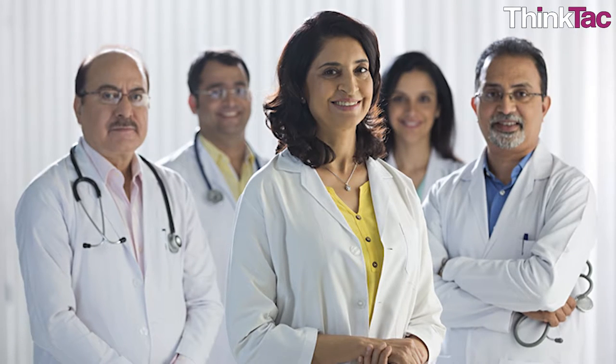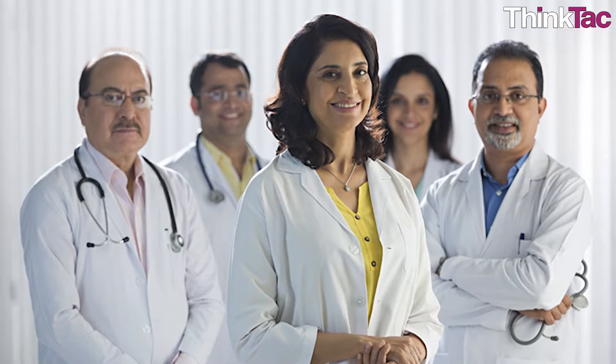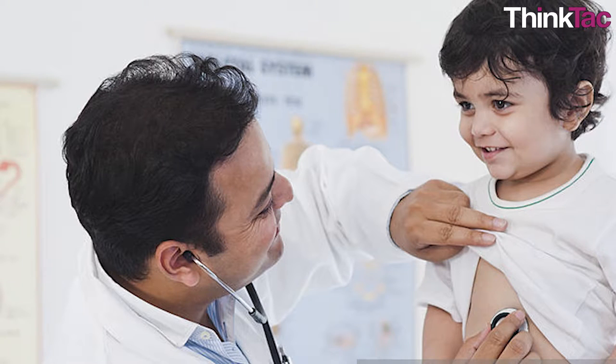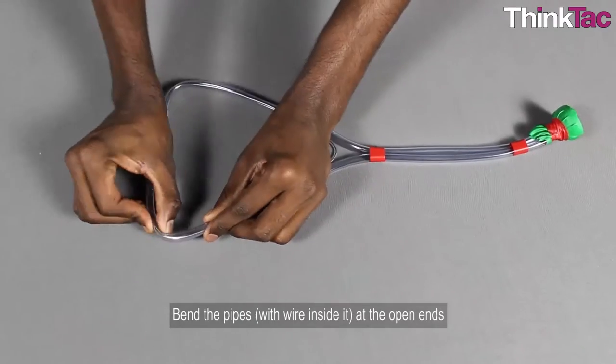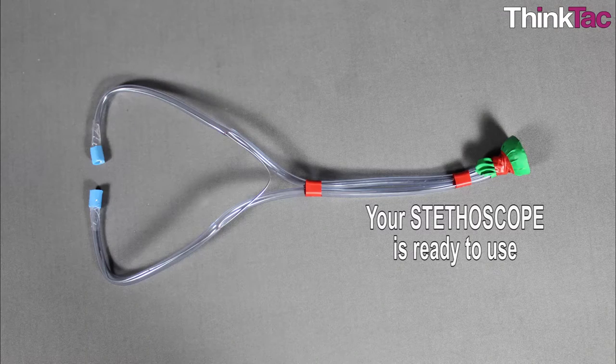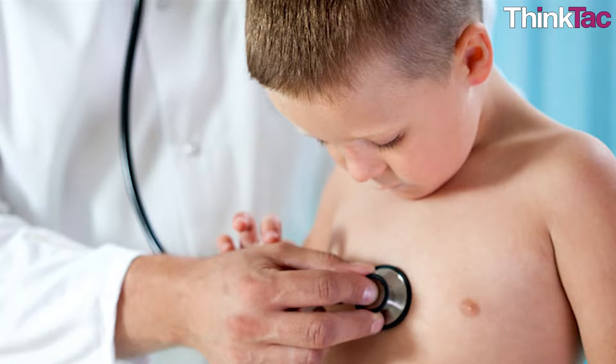Every time you went to visit the doctors, you probably saw a stethoscope hanging from their neck and thought what a cool device. If you were a curious kid, you might have even tried using it when the doctor wasn't looking. But you don't need to sneak tries anymore since you built one from scratch yourself. Even though you can't actually use this to treat patients, you can definitely use it to try and hear your own heartbeat, stomach palpitation sounds, and anything else you find curious.